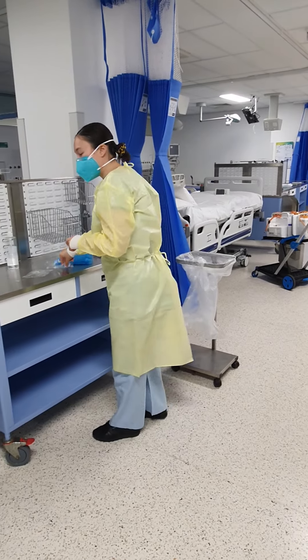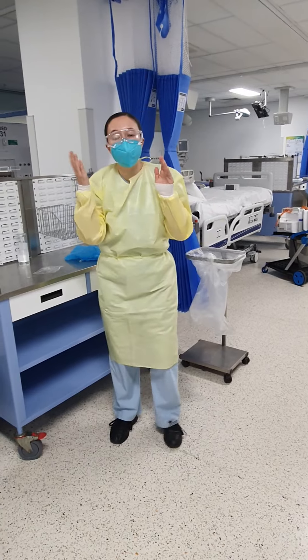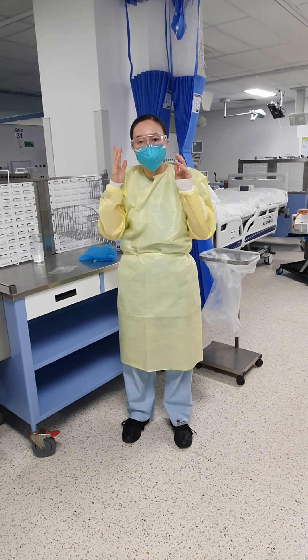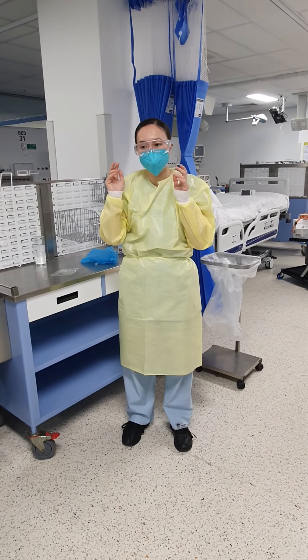Next step is goggles. Breathe in and out again. Make sure that your glasses are not fogging up. So I have a nice seal. My glasses are not fogging up.